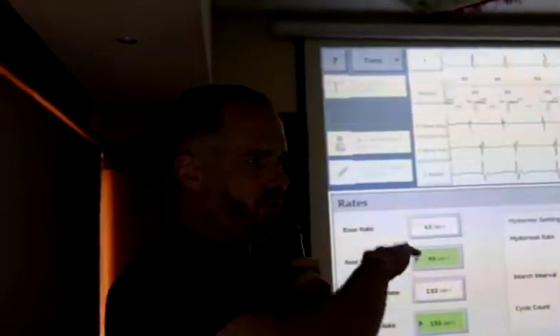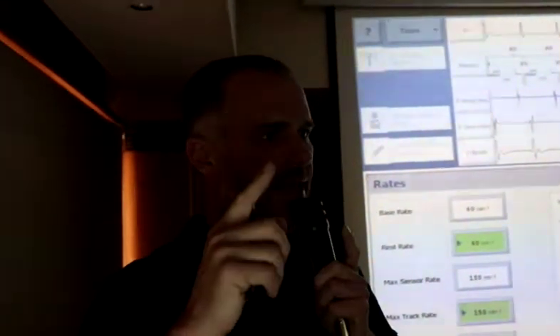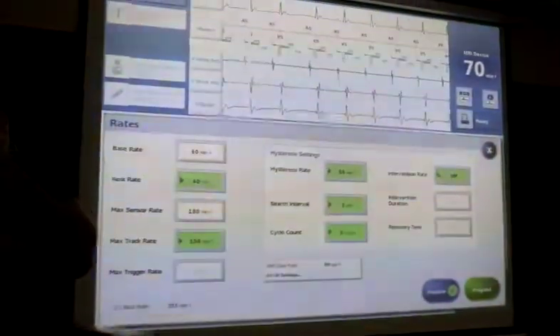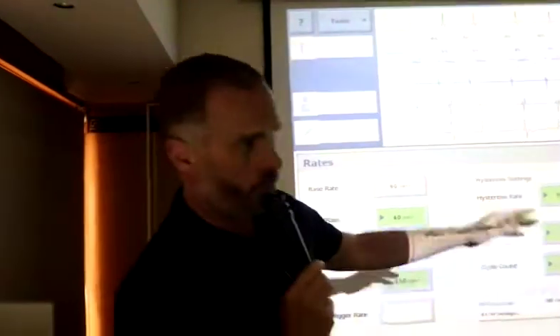If you don't give them this, they can be walking and then get short of breath because their AV node gets delayed. They sense the P wave and the device delays the ventricular pacing pulse until it's 130, okay? I've seen pacemaker patients who have had this number wrong and they are extraordinarily symptomatic on exercise. They're exercising, everything's good, and then they feel really bad, dizzy, falling over and hanging on to things. Then they say, I'm not exercising again, and they get fatter and less fit and all this kind of stuff happens.